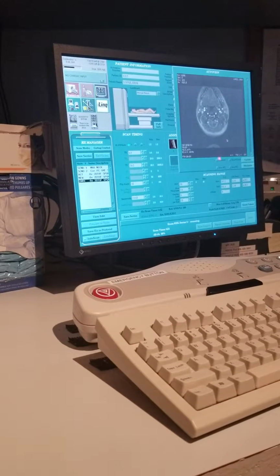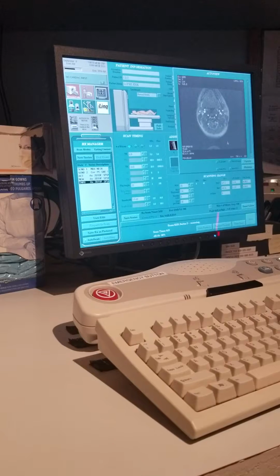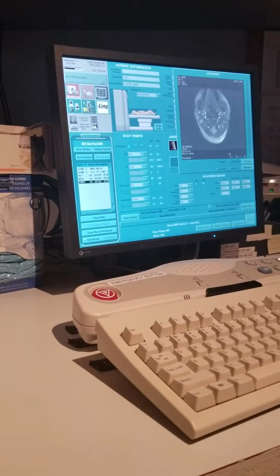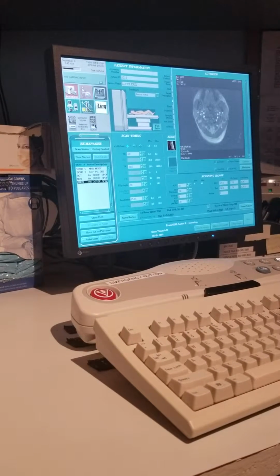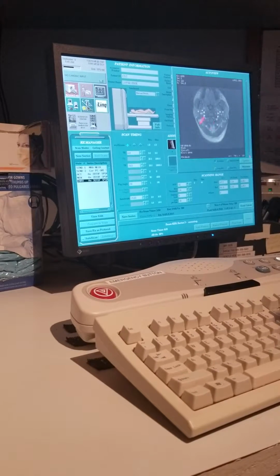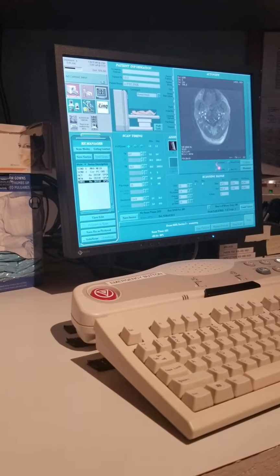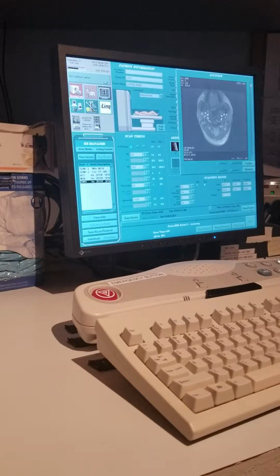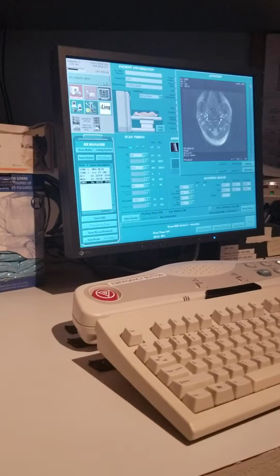So once you clicked in there, you lost your auto view. So we've already passed the bifurcation. So now we want to scroll down, but it's going to keep populating. So now we need to turn off the auto view and scroll down until you see these two come together and form a common carotid.